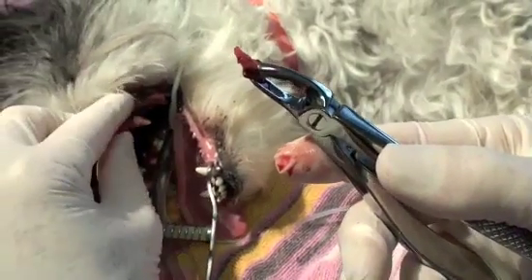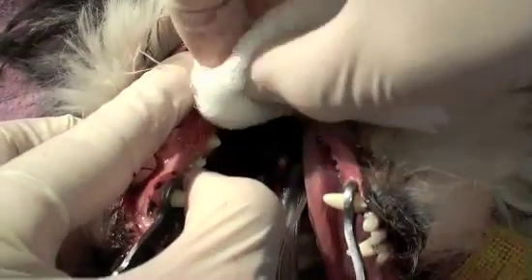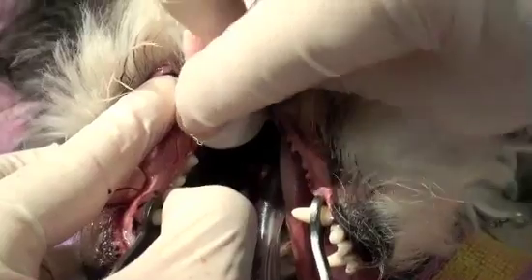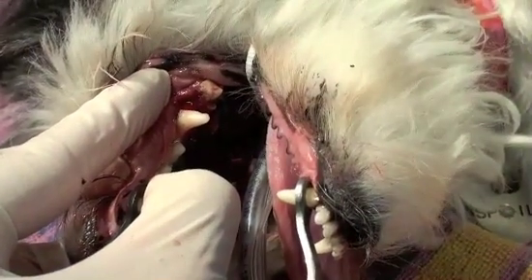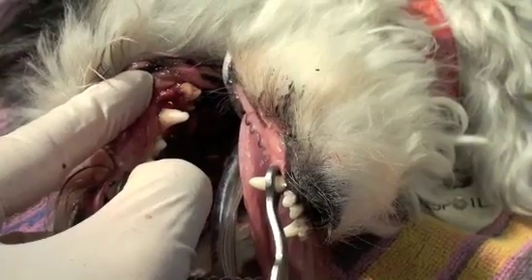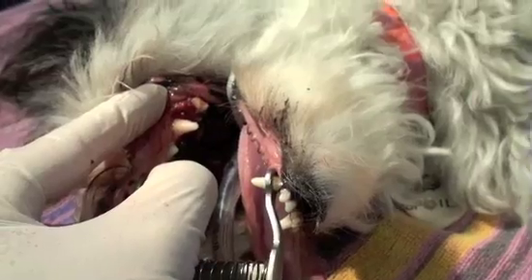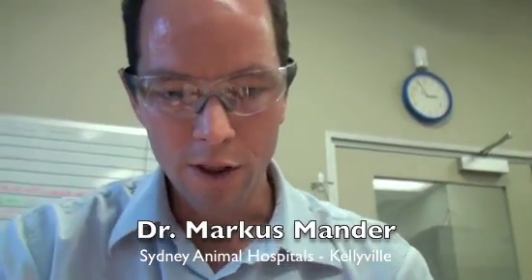His gums, although there'll be a big hole there, we won't suture that gum line over. That gum line will heal very quickly in time because of the great blood supply to the gums. So I'd expect this little man to be eating tonight soft foods for 2 to 3 days, and then to be eating dry foods again from there on in. The prognosis for this little guy is good. His mouth is actually very good apart from this particular tooth.